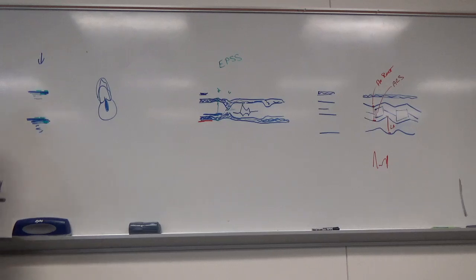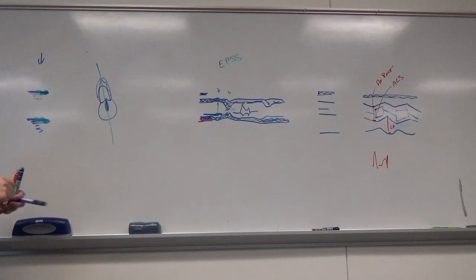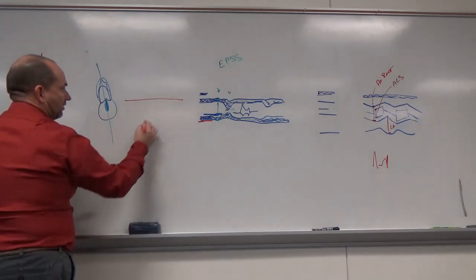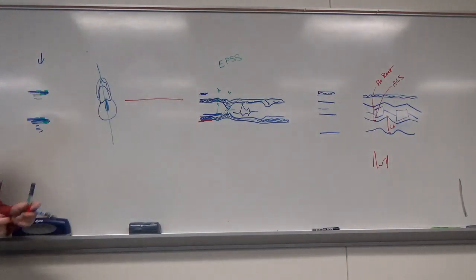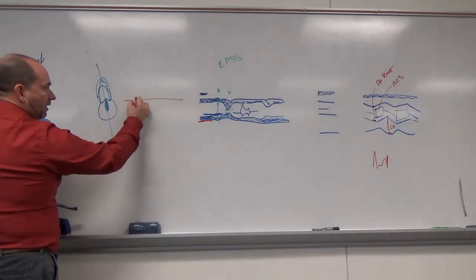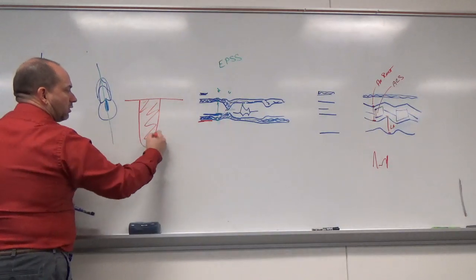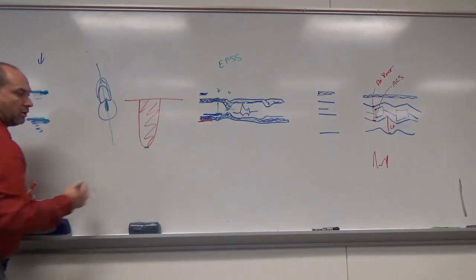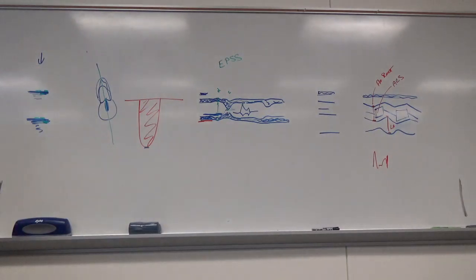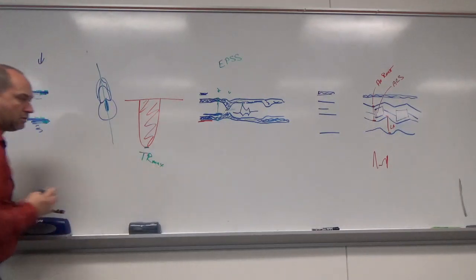And what we're going to do is we're going to line that up at a 0-degree angle and get our spectral Doppler, which is going to look like this, baseline. Which direction is that jet going, away or towards the transducer? It's away from. So I want the spectral baseline near the top, and then I'm going to be looking for a waveform something like this. It's going to be kind of hazy, and we're going to measure the maximum velocity of it there. So this is called the TR max. Why isn't it going towards?